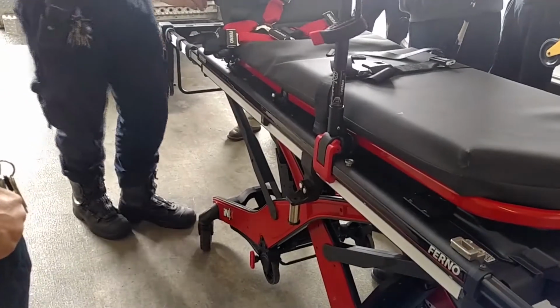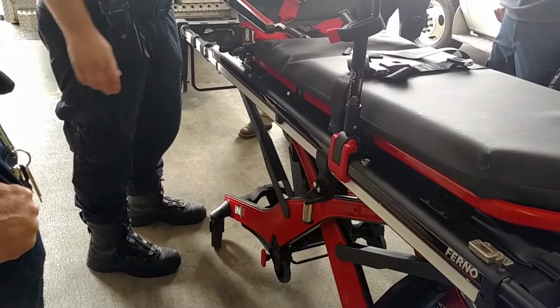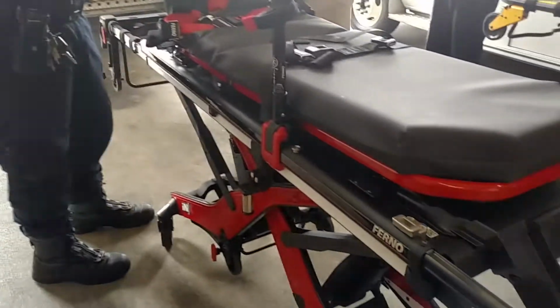when I did that first set of legs, there was kind of a little kick up at the back. What that is, is eliminating you having to do that extra little oomph when you're going to clear your rear wheels. Oh, man.